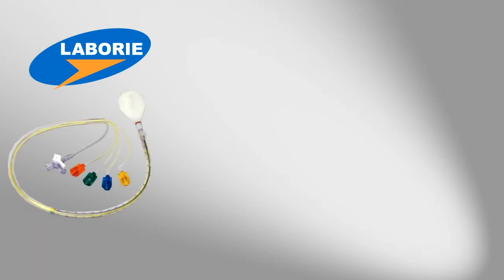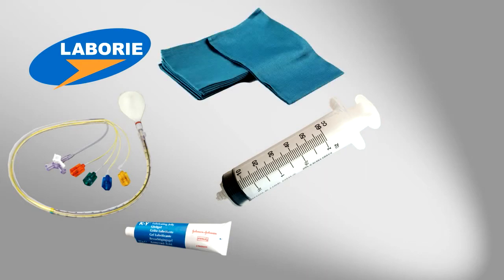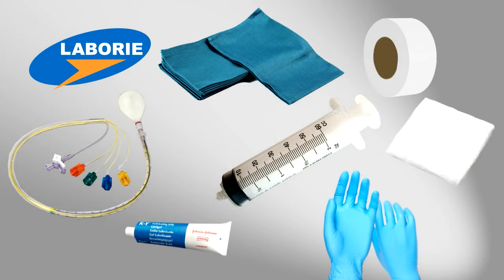Go ahead at this time and gather up the various supplies that you'll be needing. You'll be needing the anorectal manometry catheter, lubricant, a 60cc luer lock syringe, a drape or hospital gown, exam gloves, adhesive tape, gauze pads. Educate your patient prior to arrival to the test on the various things that he or she will be experiencing during the test.